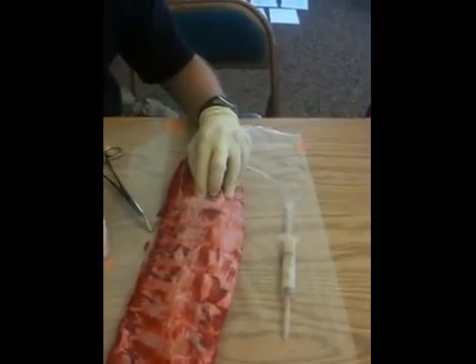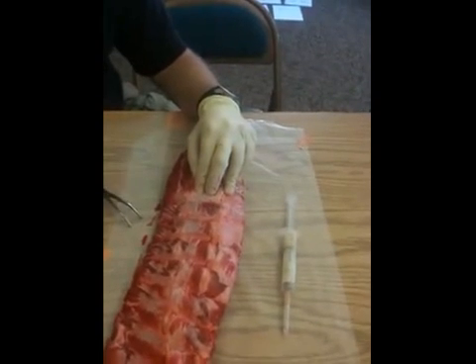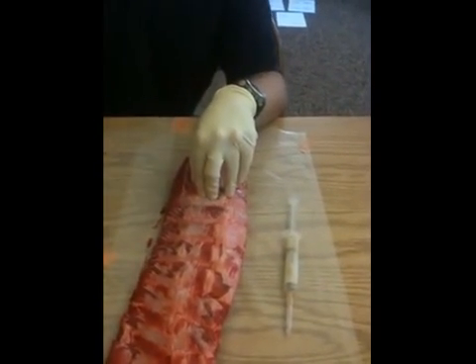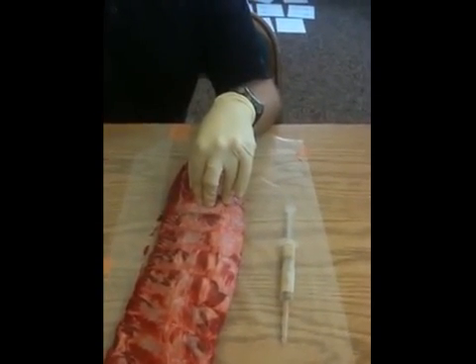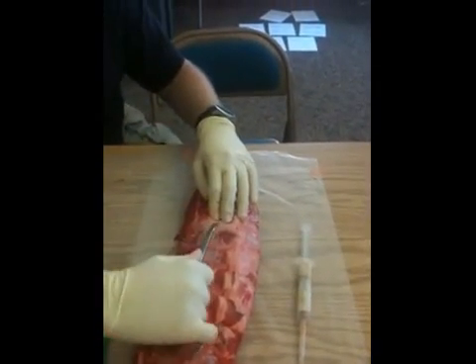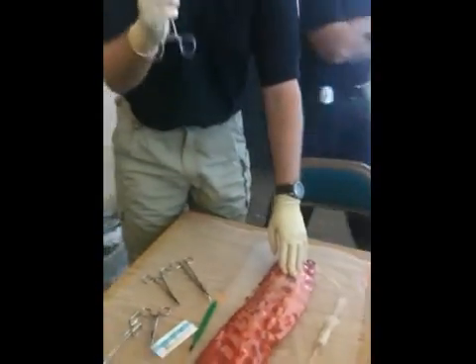Then what am I going to do? Stick your Kelly clamps in there. Spread it — you want the curved ones. Now, how am I going to hold these? A lot of people hold them way out, but you want to hold closer in. You can get a little more pressure and you have a lot more control that way.